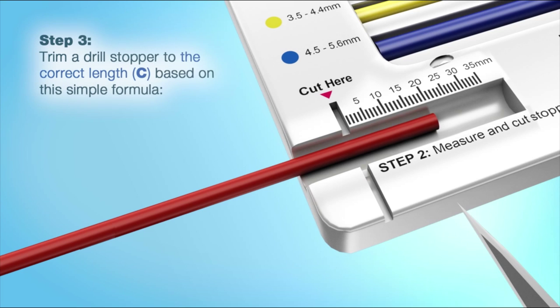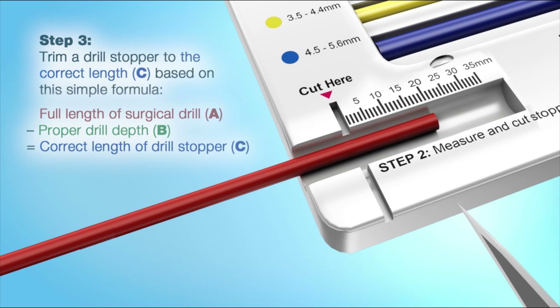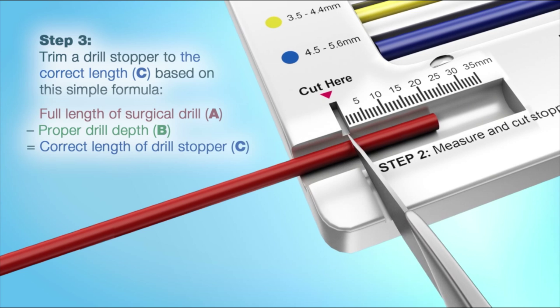Step 3: Trim a drill stopper to the correct length based on this simple formula. The full length of the surgical drill minus proper drill depth equals the correct length of the drill stopper.